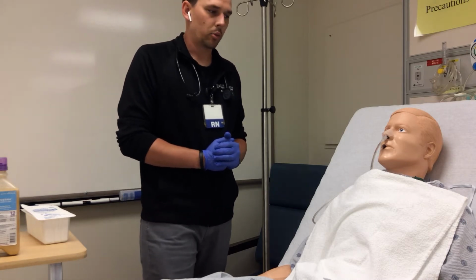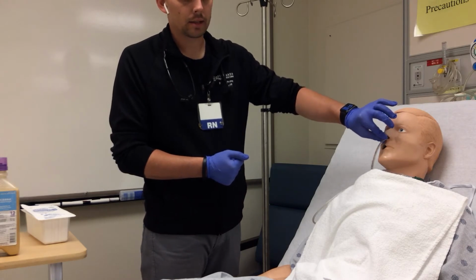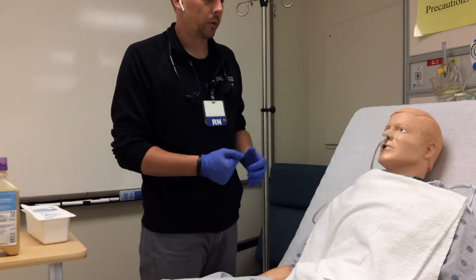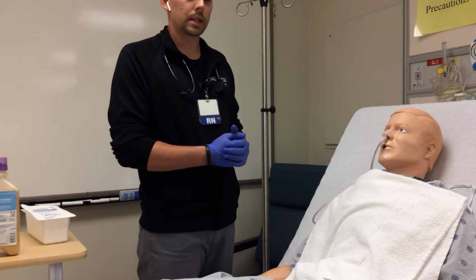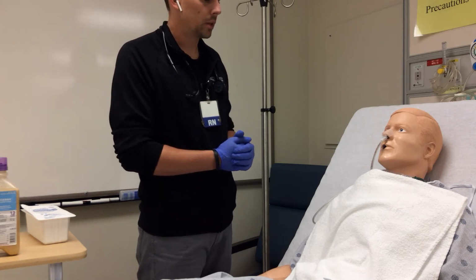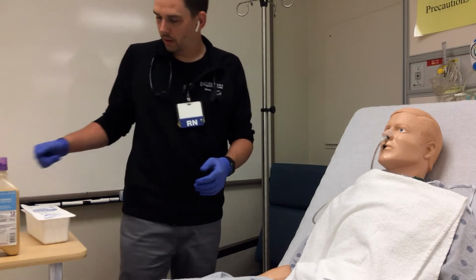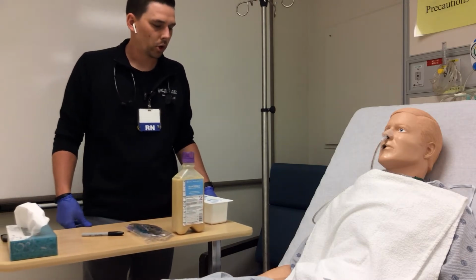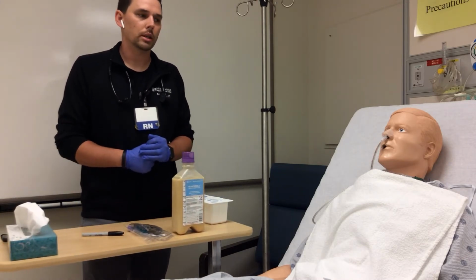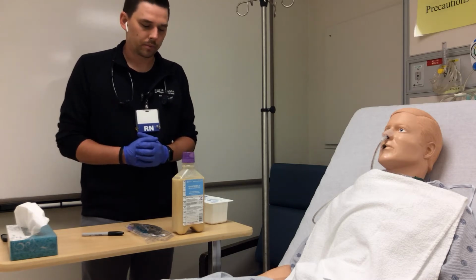But keep in mind, number one priority, we need to make sure that this NG tube is in the same place as it was in the previous assessment. We want to review that chest x-ray or abdominal x-ray to make sure that we have visualization of the nasogastric tube in the stomach and we are comfortable with the placement. So first thing we need to do is gather our equipment, get the bed to a workable position, verify our patient, and all those initial steps that we do prior to our skills.